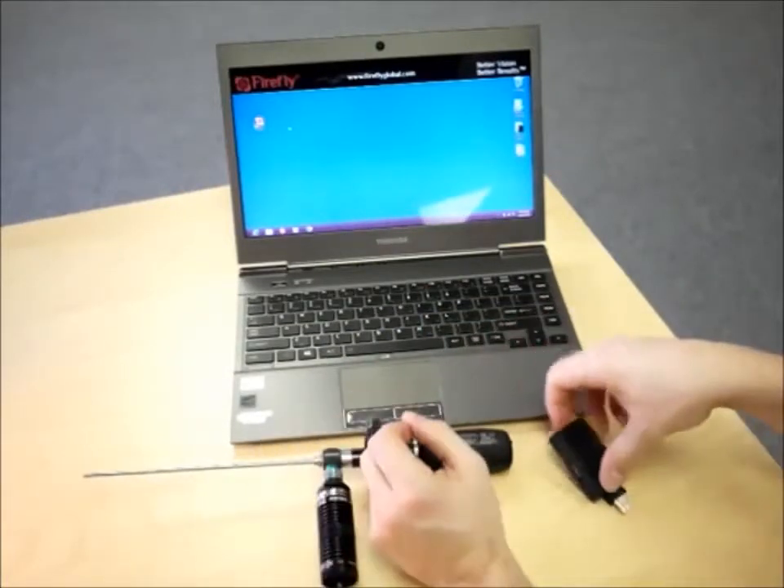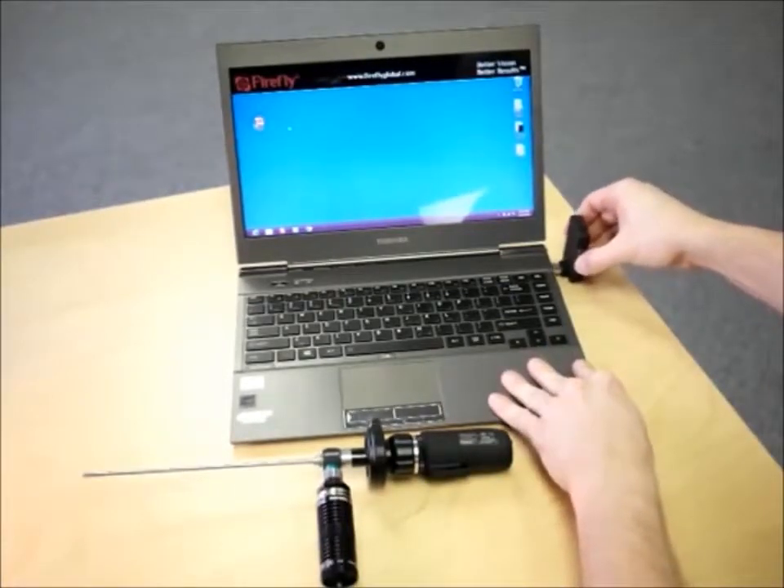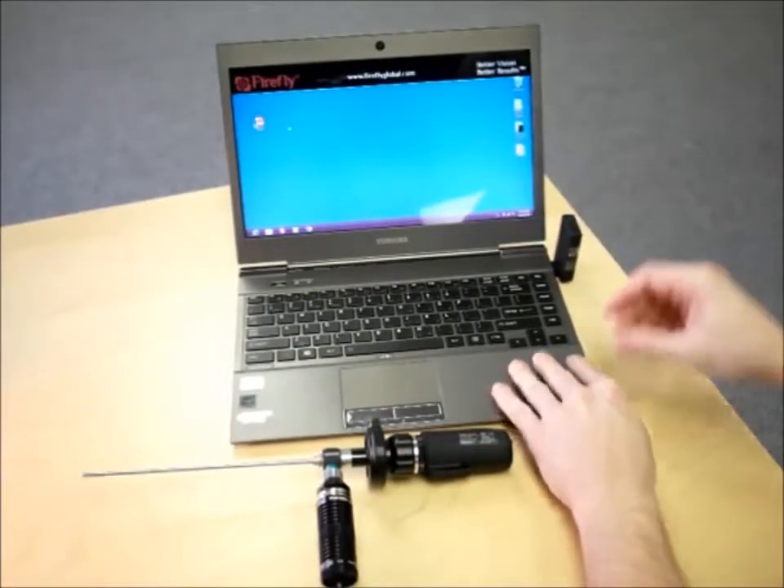Now that the camera is assembled, we can attach the wireless receiver to a USB port and double-click the Firefly Pro software.